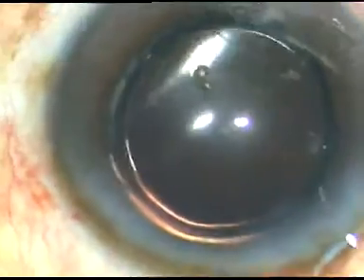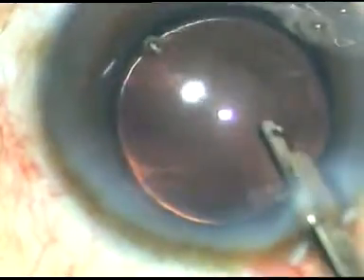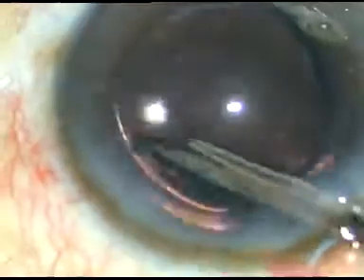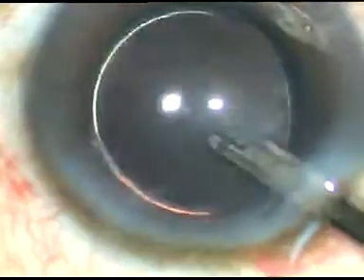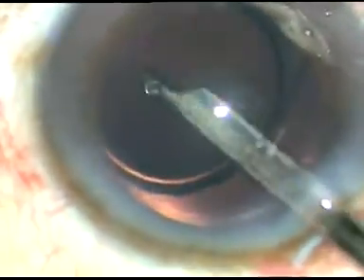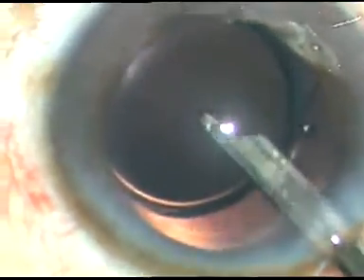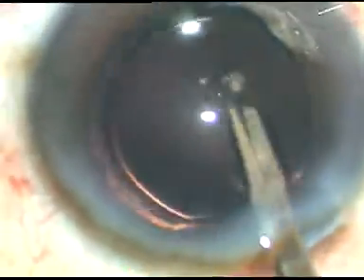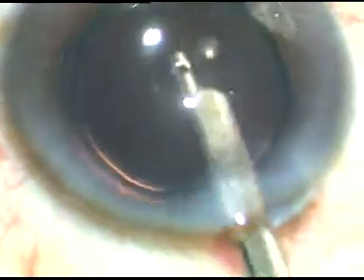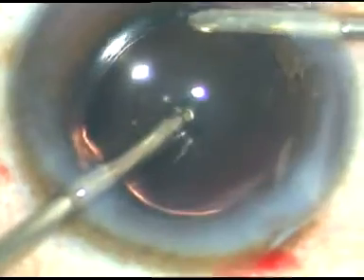No financial interest, but let me speak the truth. Now the viscoelastic substance is flushed and irrigated out from the anterior chamber and from behind the IOL. It is most important to remove the viscoelastic substance thoroughly if you want to avoid post-op rise of intraocular pressure and steamy corneal edema. Bimanual irrigation-aspiration is also used to remove the viscoelastic substance in addition to the Simcoe cannula.